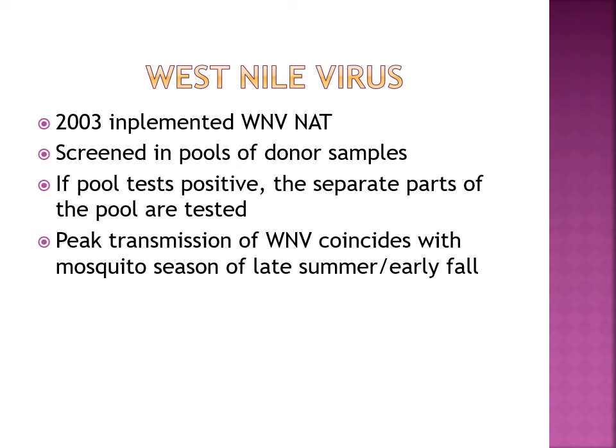About the first time when I was working at the Blood Connection, working in the testing part of it, we had a policy in place that if we had a positive pool, then for the next 2 weeks, we had to test individual samples. And for that summer, oh my God, it was awful, because just when we would almost be in the 2-week window, we'd have another positive pop up, and then we'd have to individually test again. And it was bad. Of course, going from pooled testing to individual testing, you are burning through reagents. And with this particular machine, we didn't necessarily pay for the machine itself. We paid for the reagents to use the machine. So they definitely got their money's worth that year.